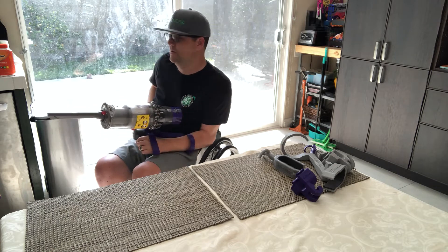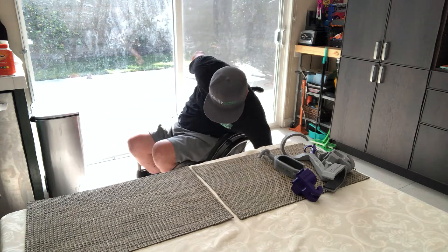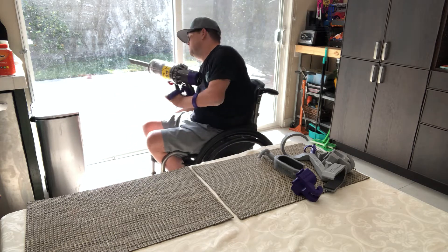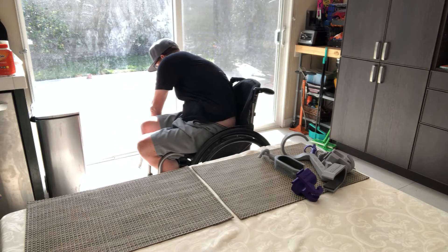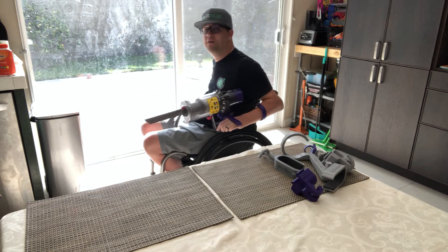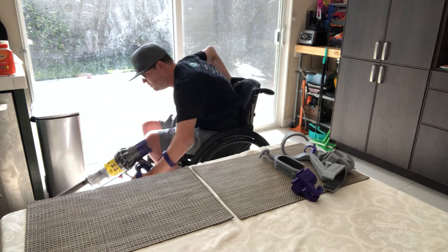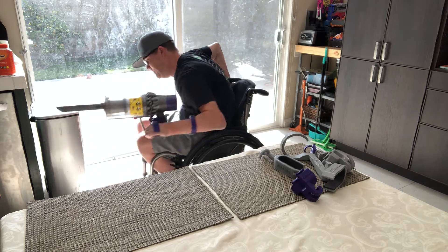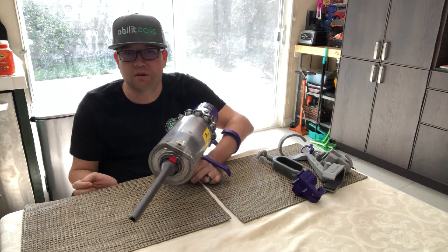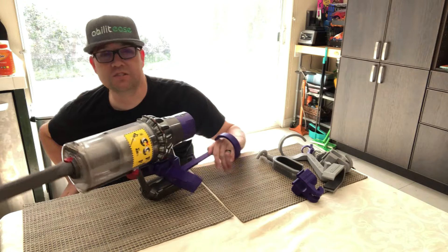This is comfortable and not too heavy. If you don't have a lot of shoulder function it might be hard, so it's going to be different for everyone. All of us with spinal cord injuries are like snowflakes. Depending on your comfort level and balance, you might want to put a strap over your stomach and chest. This design was meant to be flexible, but you may need to incorporate other things like a velcro strap.